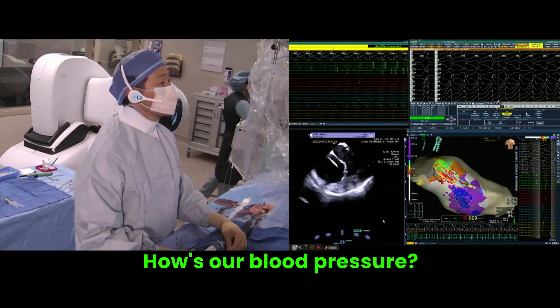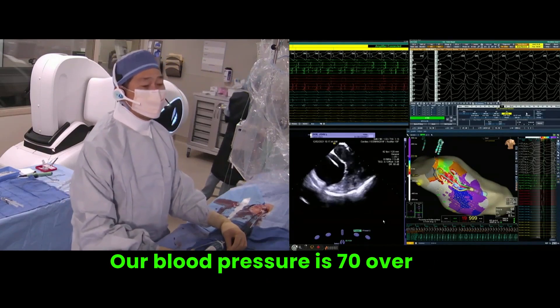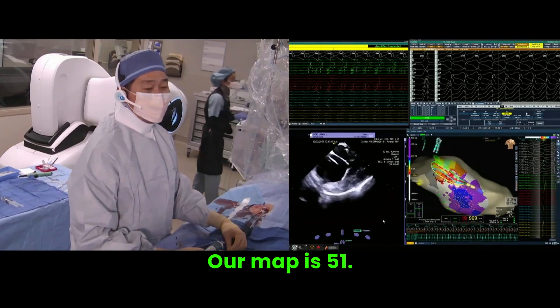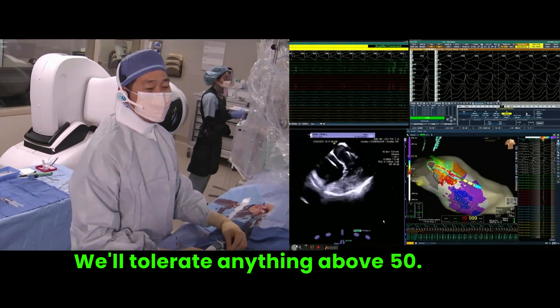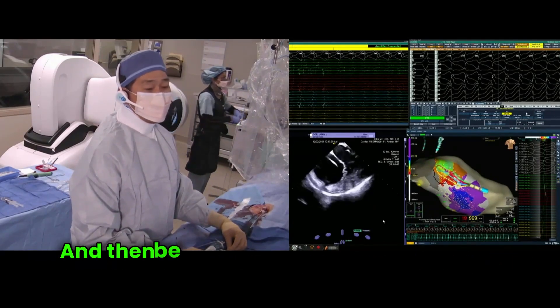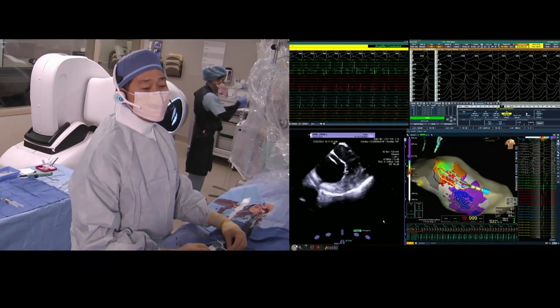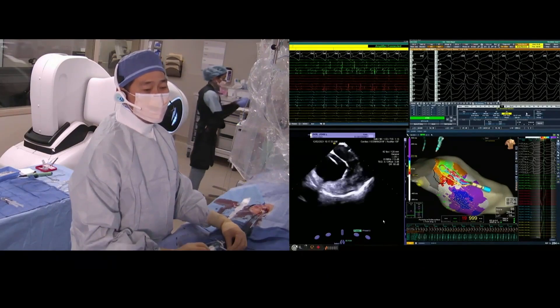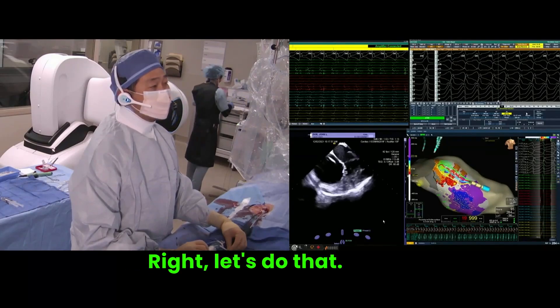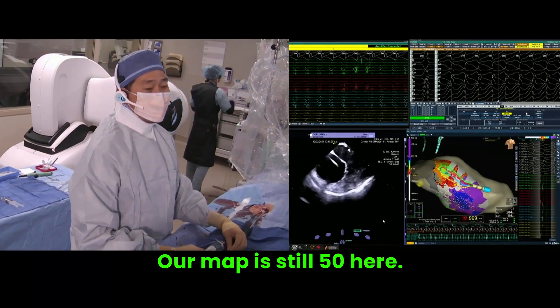How's our blood pressure? Our blood pressure is 70 over 40. Our MAP is 51 — we'll tolerate anything above 50. Be ready to cardiovert here and shock. Our MAP is still 50 here.